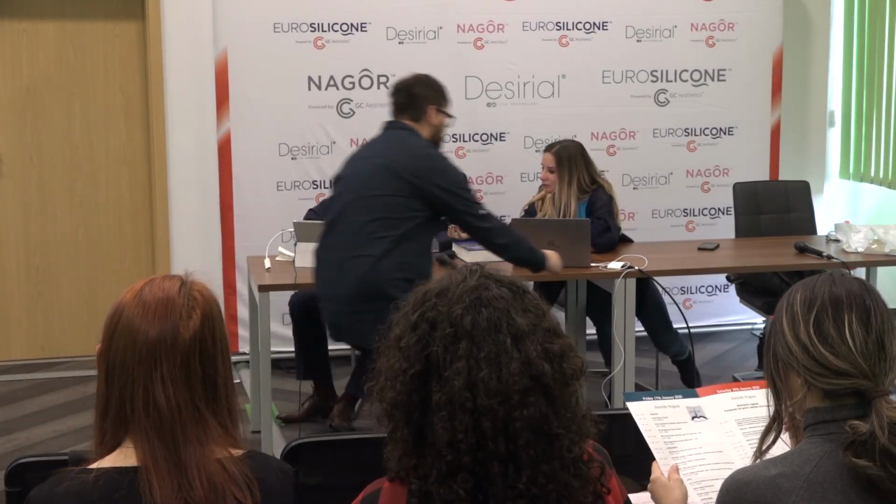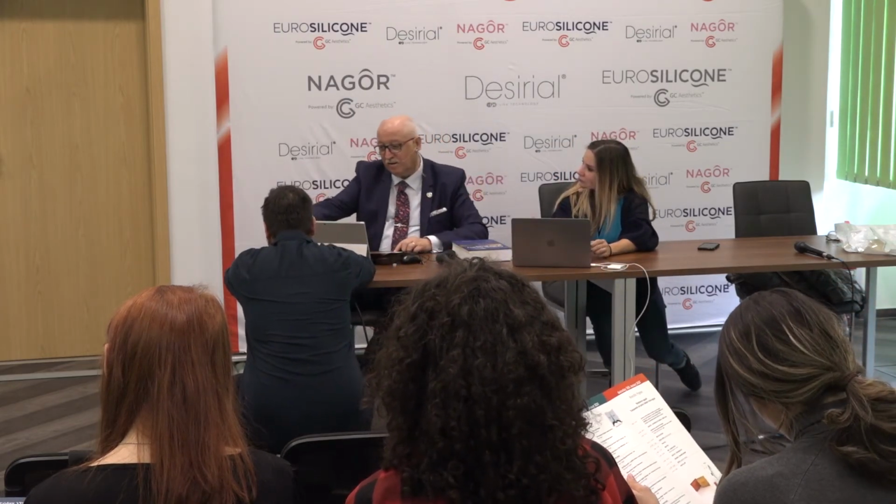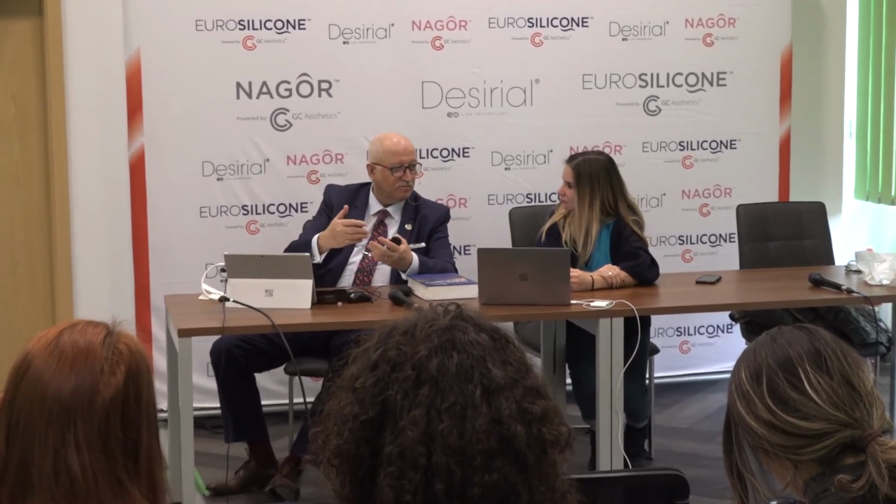I want to ask you about the periareolar incision. I did this only when I have to reduce the areola or when I have a tubular breast, but are you happy with the scar? In my experience, I started both the treatments, the submammary fold one and the periareolar one, and I have a different degree of scar deformity in both cases.